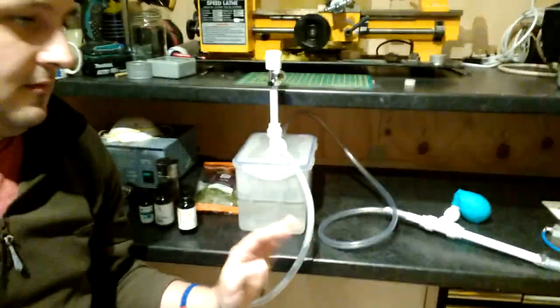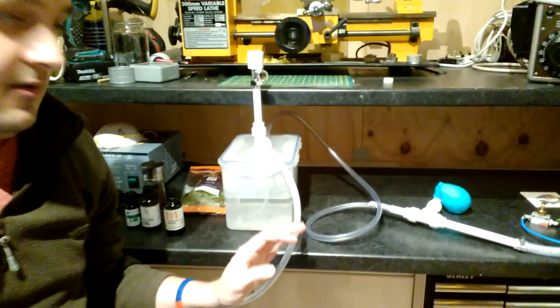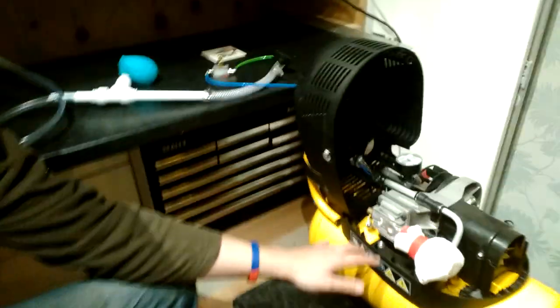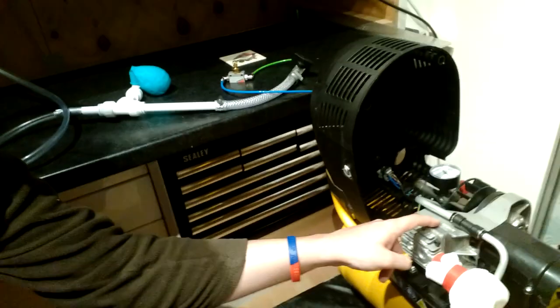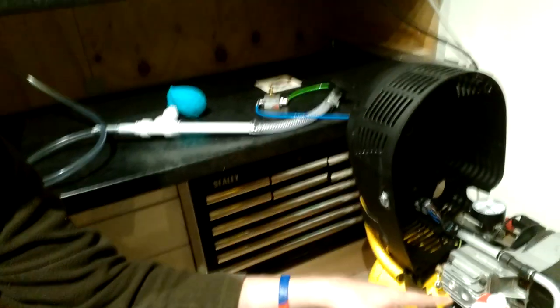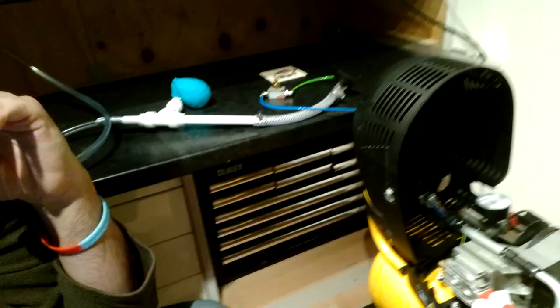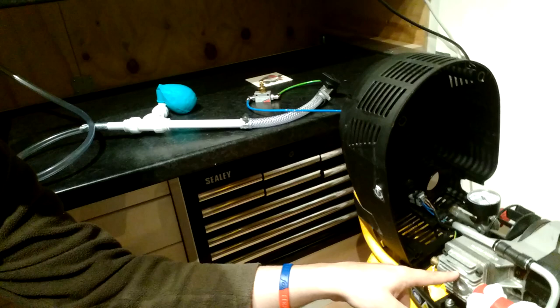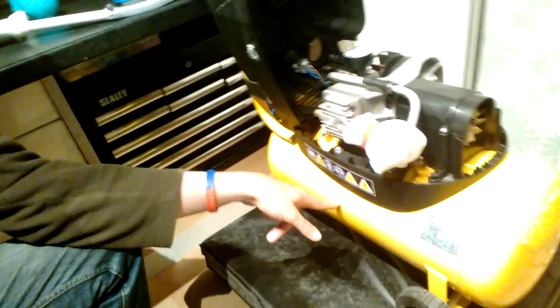So there are essentially only a handful of parts to this. You've got a compressor. Now this is a reciprocating compressor. There's a piston in here which the motor drives backwards and forwards, which with a couple of one-way valves draws air into the cylinder and then blows it out under pressure into this cylinder below.